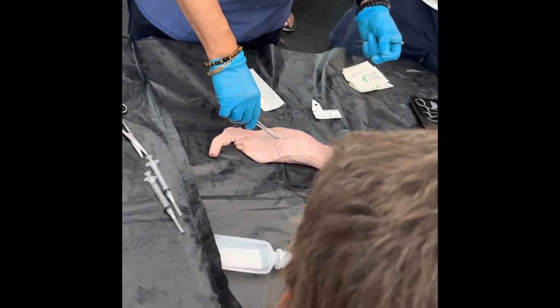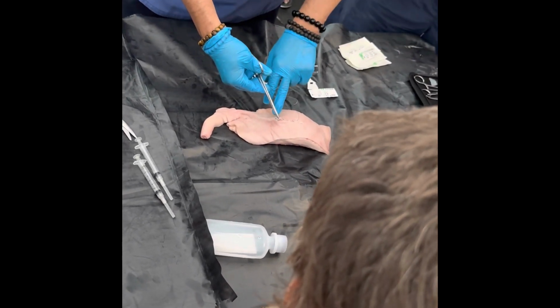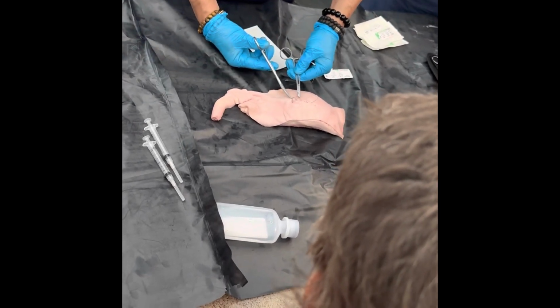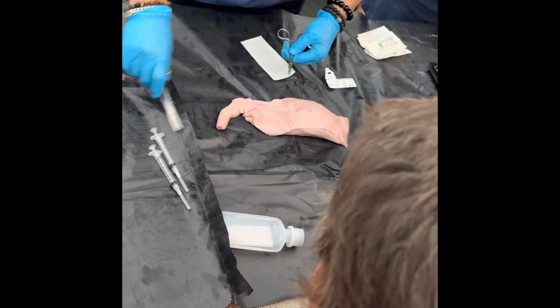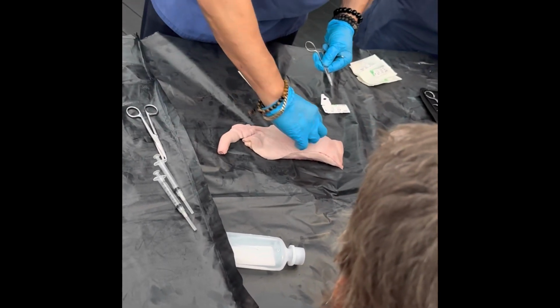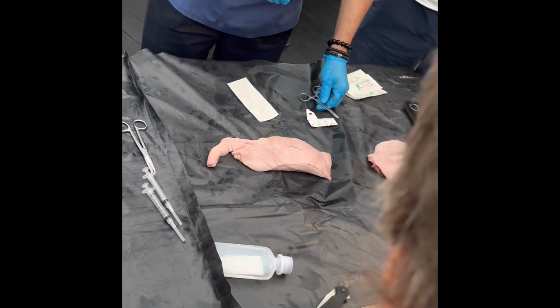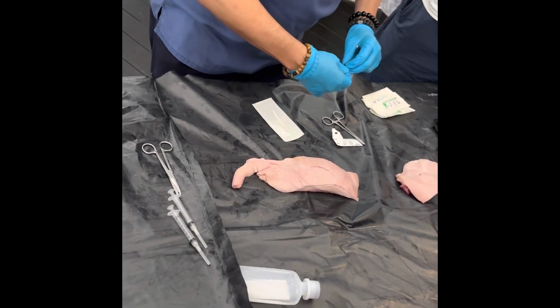Okay. When you're gonna take it off, you're gonna cut the stitch right there at the knot. So the assumption here is these are really small bleeds, little vascular bleeds, but just the pressure of the stitches is gonna cause them to coagulate, cause them to stop. Pretty much. Can you show us the initial stitch where you looped it around? Okay. Just one more time.